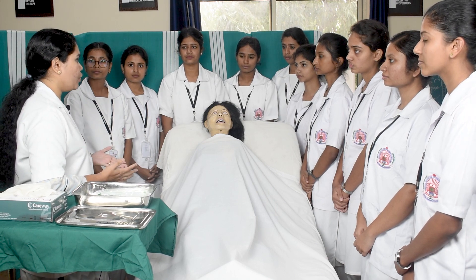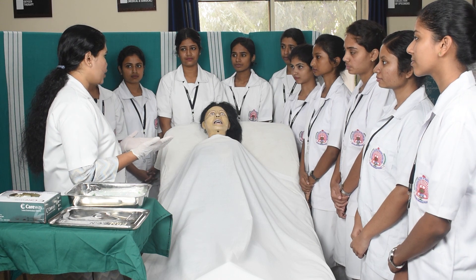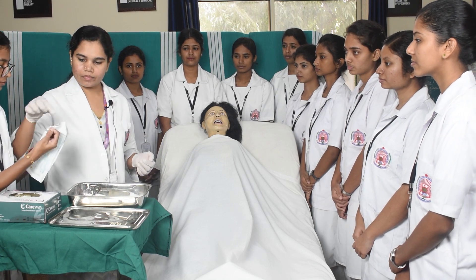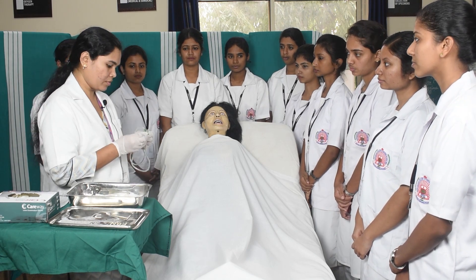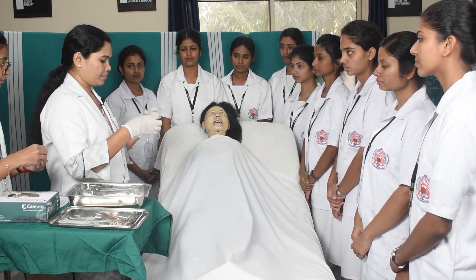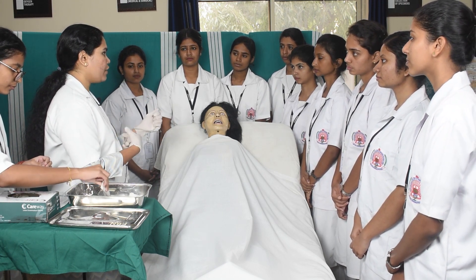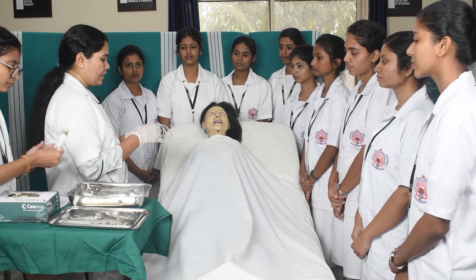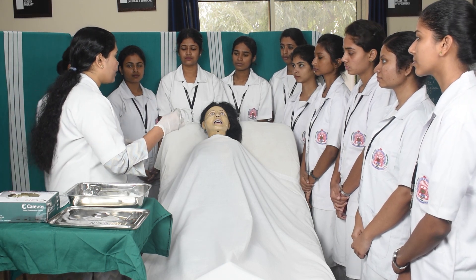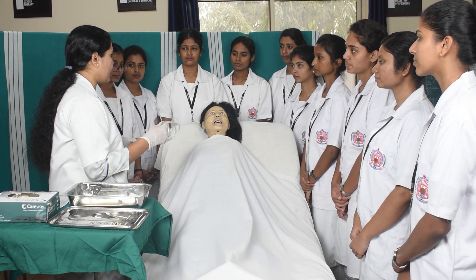Before going to do the procedure, we will obviously be doing hand washing. I have done hand washing and put on gloves. Before starting, we have to explain the procedure to the patient — if the patient is conscious, we must explain the procedure to them.